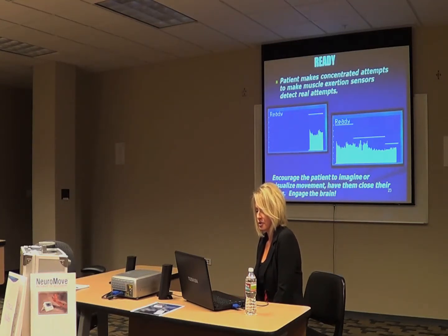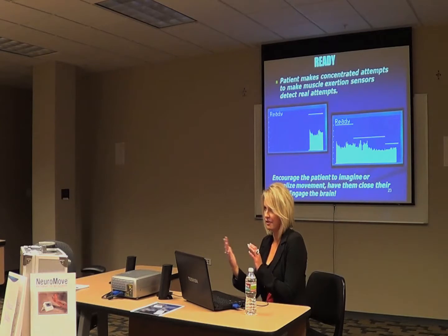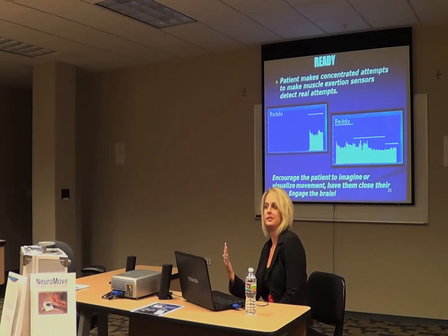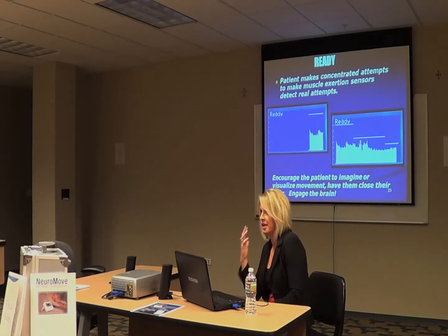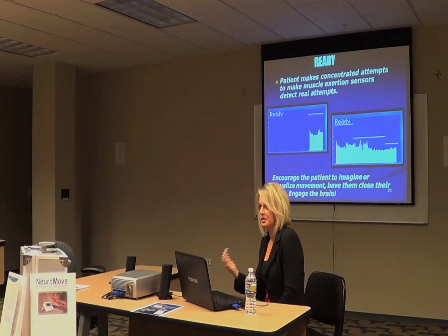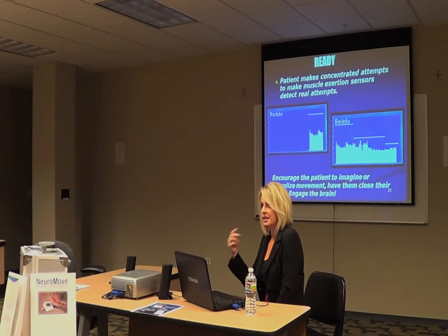You want to encourage the patient to imagine or visualize movement, so have them close their eyes and engage the brain. I also find that sometimes actually seeing something in front of them is just as important. So you might put a hand right in front of a patient and say, I want you to try to reach up and slap a high five. Sometimes noise will stimulate the actual visualization. So whatever you can do as a therapist to engage them into their imagination to make this work better, be creative with them if they're struggling. Once they get the idea of the therapy, they usually can snap right along and get it.